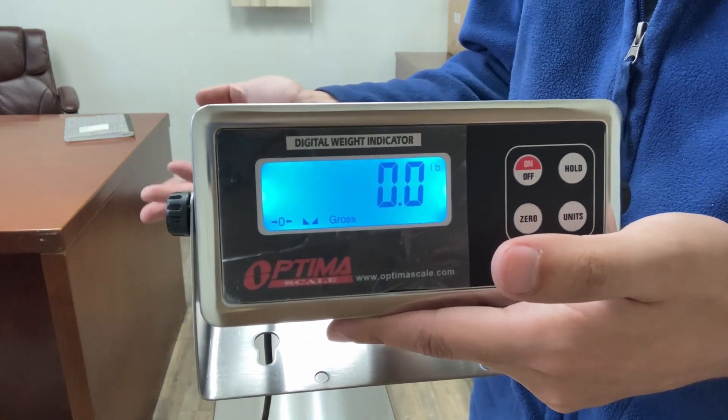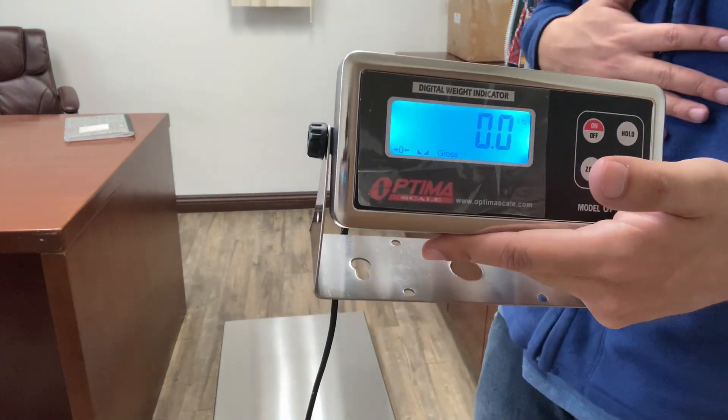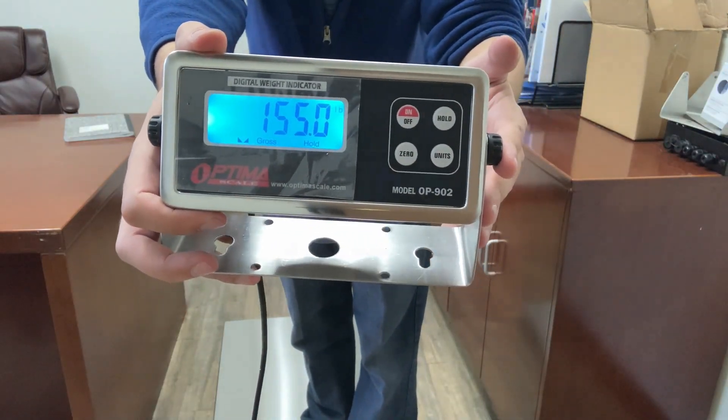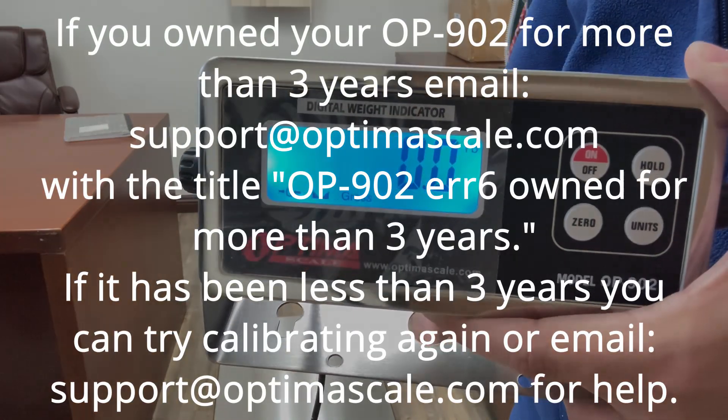You'll see 0.0 — that's good because there's nothing on it. Now put your weight on it to see if it's correct. In my case I'm just going to stand on it and it should be correct. And my scale went back to zero — there's no weight on it.